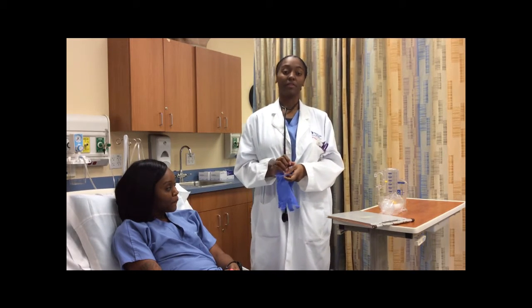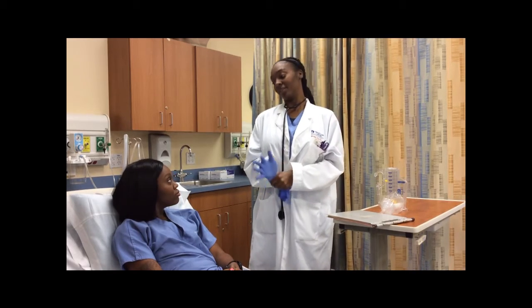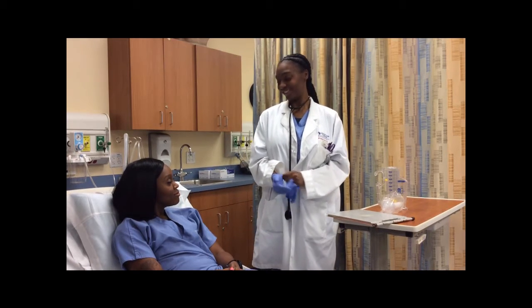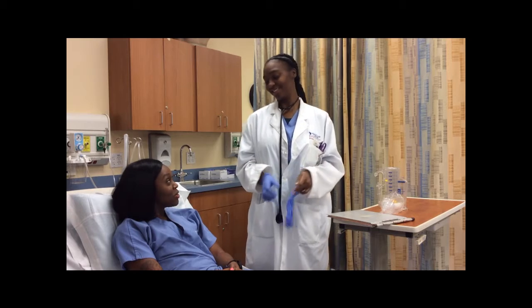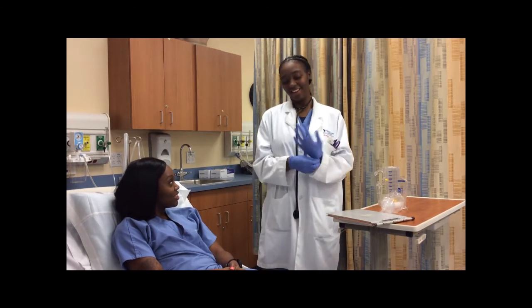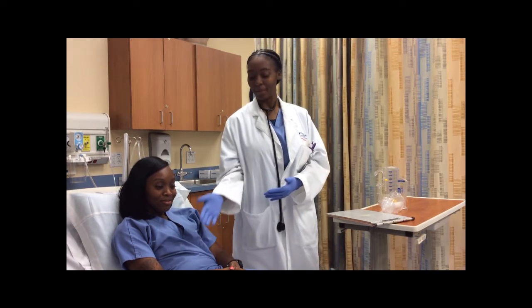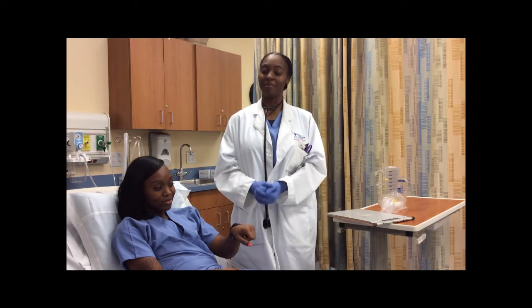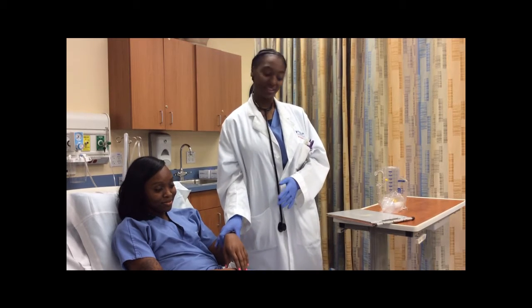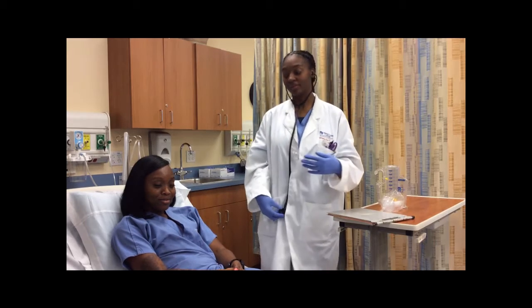I introduce myself to the patient, and I check patient identifiers. Hello, my name is Armenta. I'm a respiratory therapy student. Your name is? Doris St. Louis. And your date of birth? May 13, 19. I check the patient's wristband for the medical records number to make sure I'm doing the right patient. Next, I check my patient's vital signs and breath sounds.